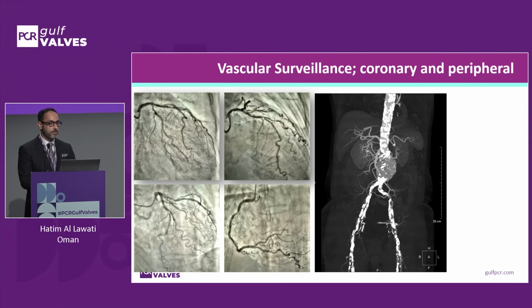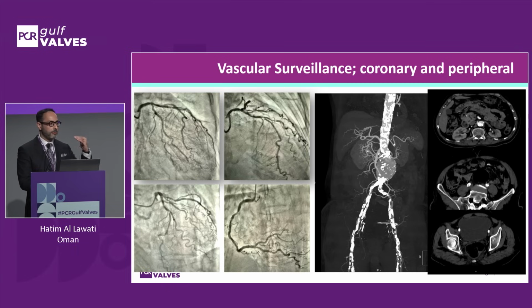She had an aneurysm just above the distal aortic bifurcation. And if you look at the cross sections in the aorta, at the level of the renal arteries, in the common iliacs and external iliacs, there was very calcific, obstructive disease, making femoral access unfeasible.